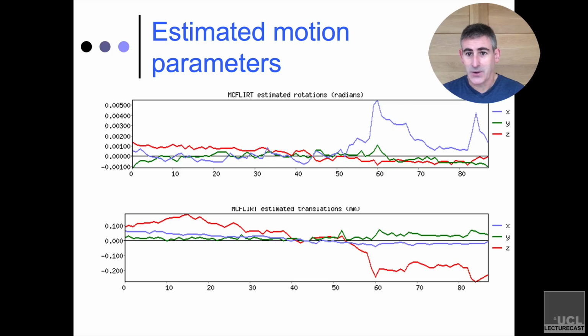The problem is that all of these software packages scale these to the largest movement. If the largest movement is something that's under a millimeter, don't worry about it. Similarly, if you convert these radians to degrees and you discover that it's under a degree or 2, not a problem. That's a good participant.